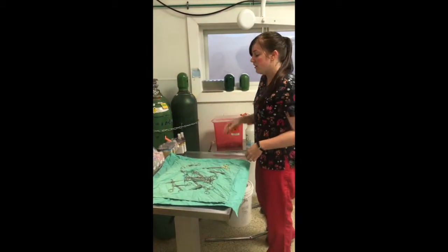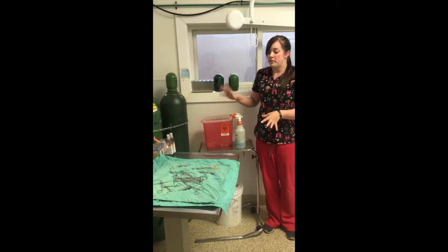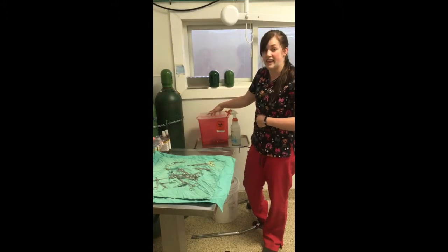This sharps container does not live inside our surgery suite. I'm just using it for demonstration purposes. We keep this in our treatment area. So all of our sharps are out there, but they do get disposed in the sharps containers.